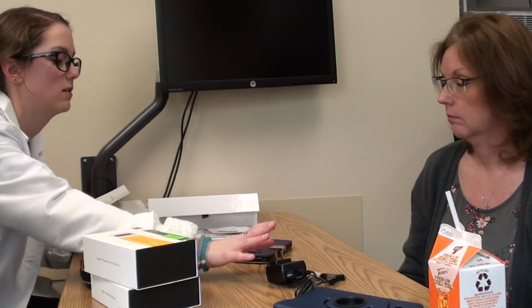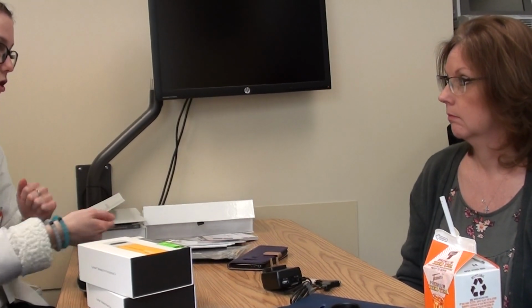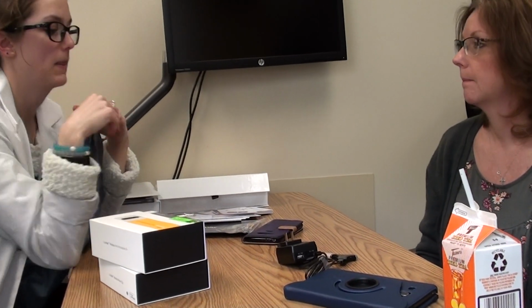Okay. So these are your cases. You're gonna charge these every time you take it off at night. You're gonna charge them at bedtime, at nighttime. So when you get up in the morning, you're gonna put the implant on. You're gonna take a new battery, put it on, wear it all day. Take it off if you're gonna take a shower or a nap, but otherwise you'll wear it all day long, okay?